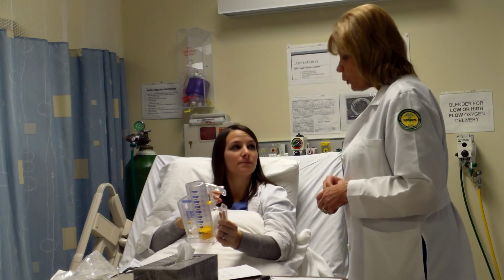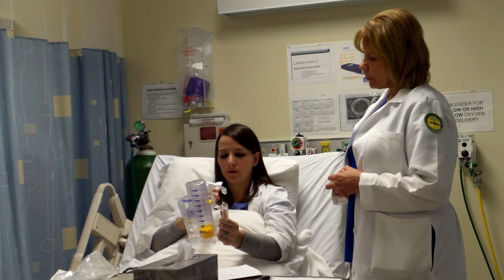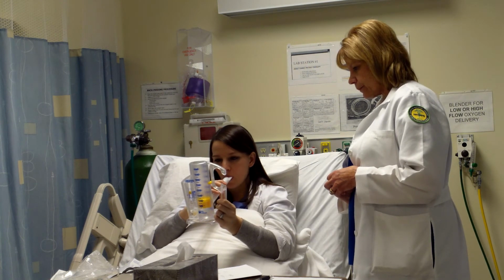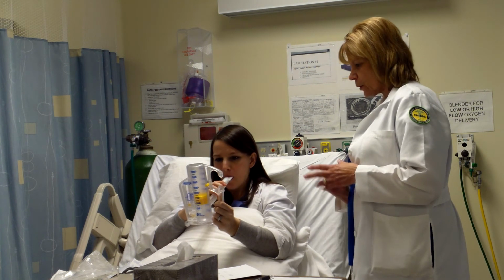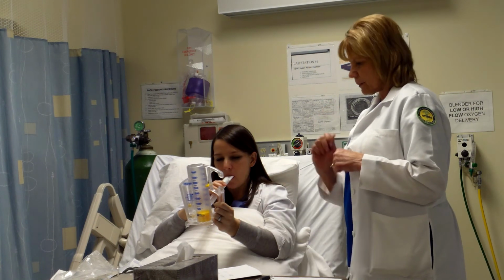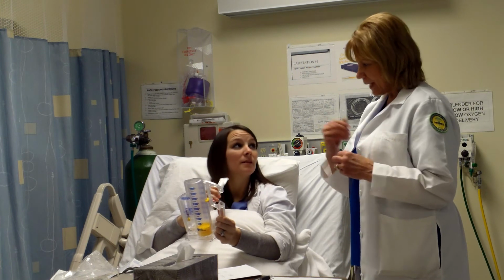Okay. So let's try it again. Exhale normally. Mouthpiece in your mouth. And breathe in. That was better. Hold your breath. Hold your breath till the piston drops. Take the mouthpiece out and exhale. Now you got the hang of that part. All right, we're going to add a step now.